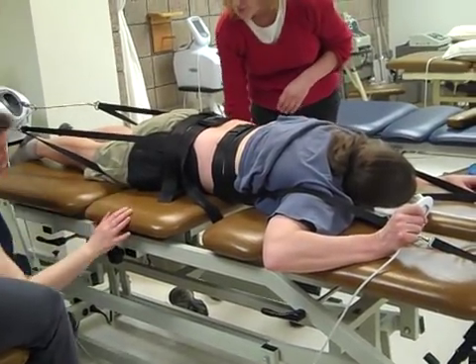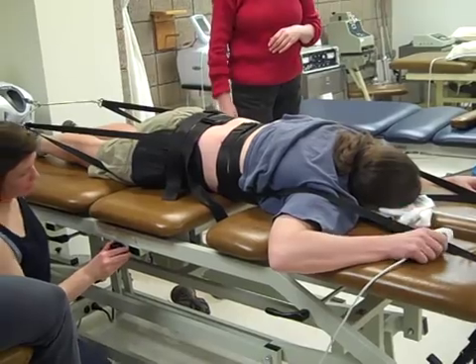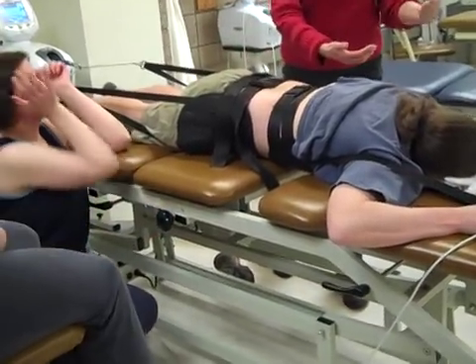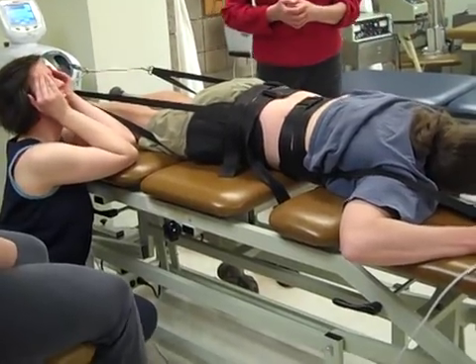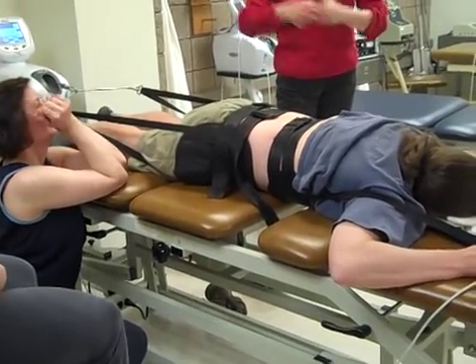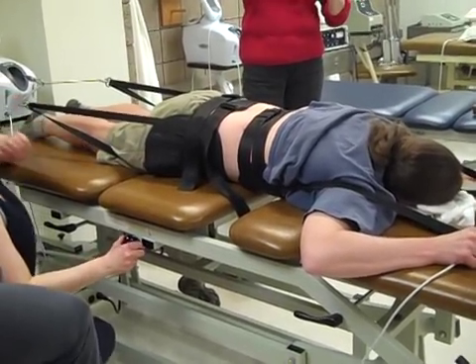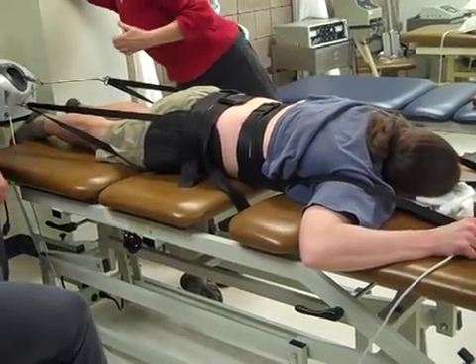Okay. Before you do that. Oh, okay. Don't push it. Oh. Okay, why don't we push it back together? Because then I'll push them together. Yeah, we've just undone everything we did. And so that's why that bar under there is this long, so we can just lock it in that place. So what is it telling us?